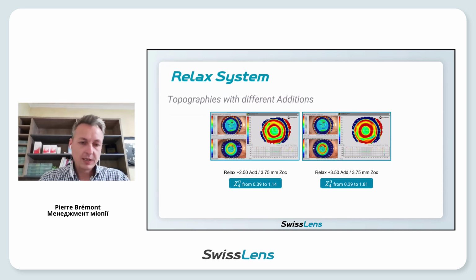The other option in myopia management with Relax is the amount of defocus. Here we have the exact same central optical zone, 3.75, on another patient, who was only 0.39 in spherical aberration before the treatment.